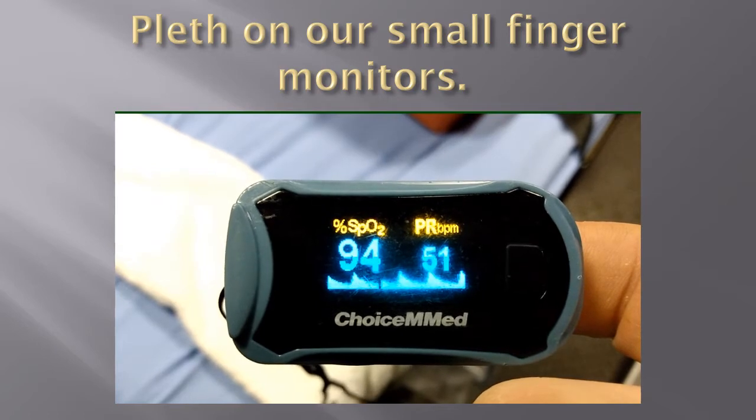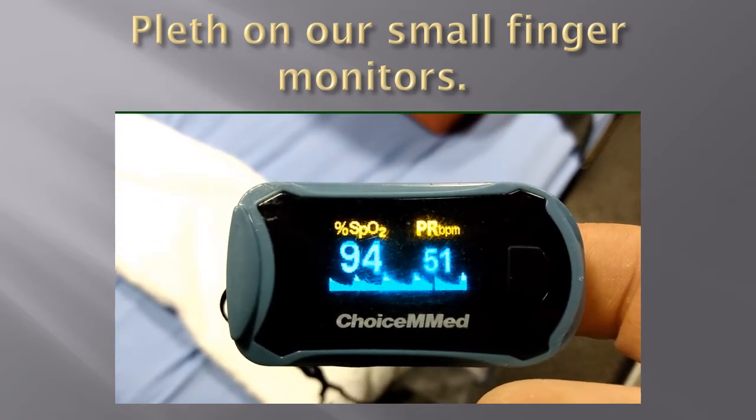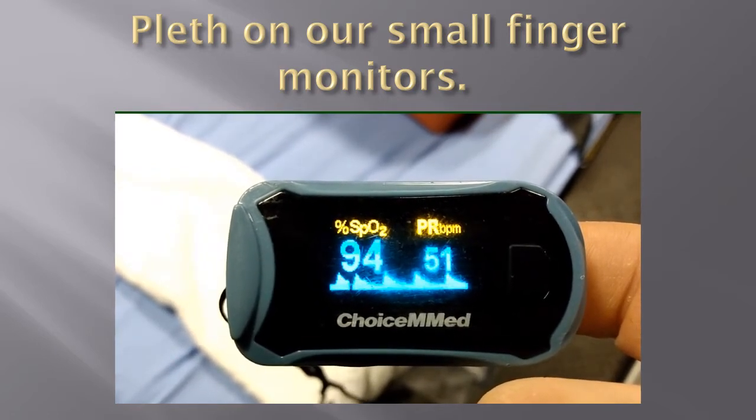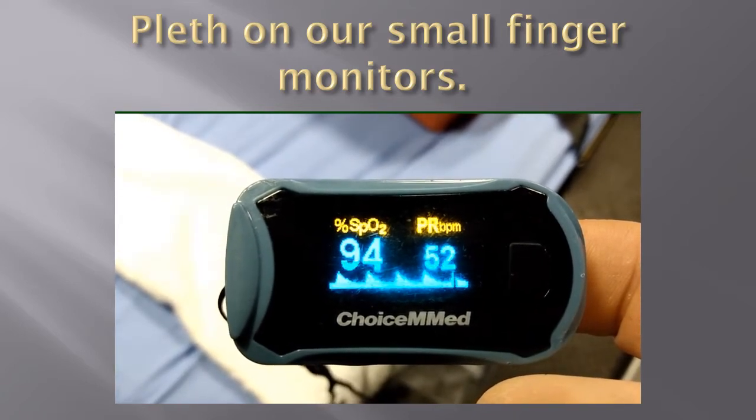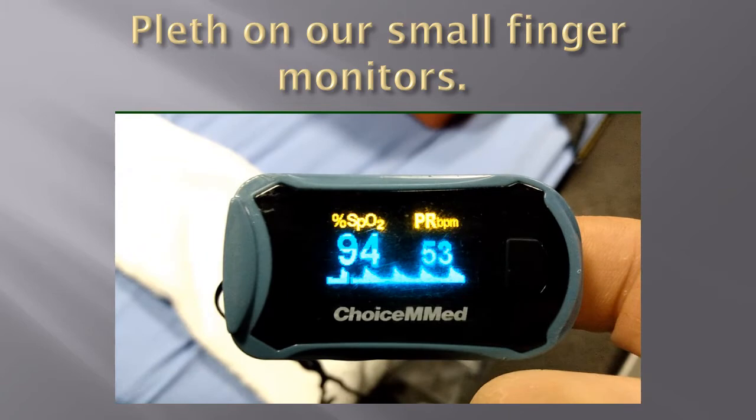As you will see here, some of the smaller standalone pulse oximeters that we have started carrying will also show a Pleth waveform. However, these are not nearly as accurate or detailed as the Pleth that is presented on the monitors.